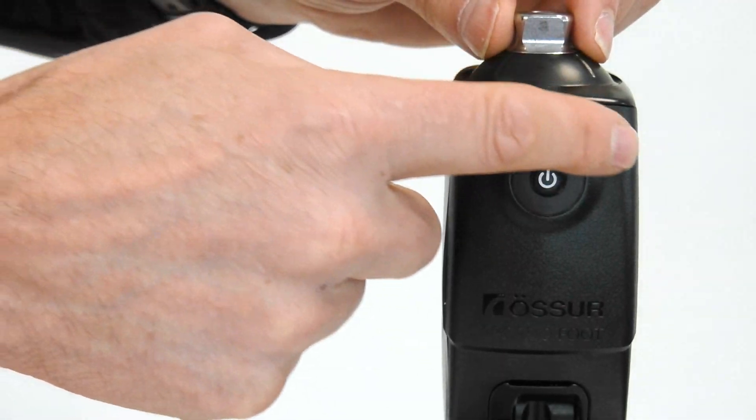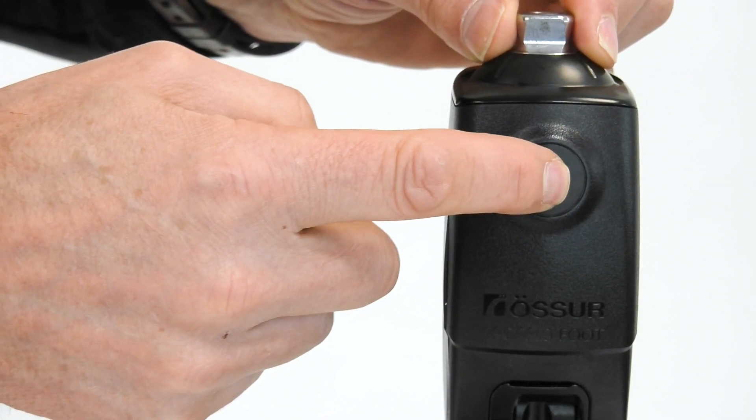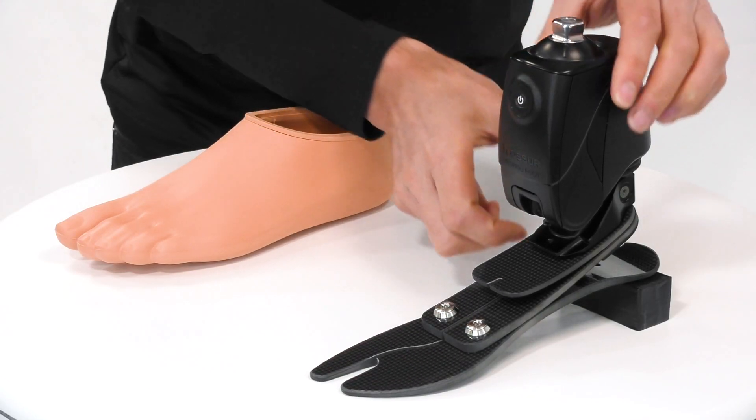At the front here we have this raised user interface, and by pressing the button once, these lights give us an indication of the state of charge of the battery.